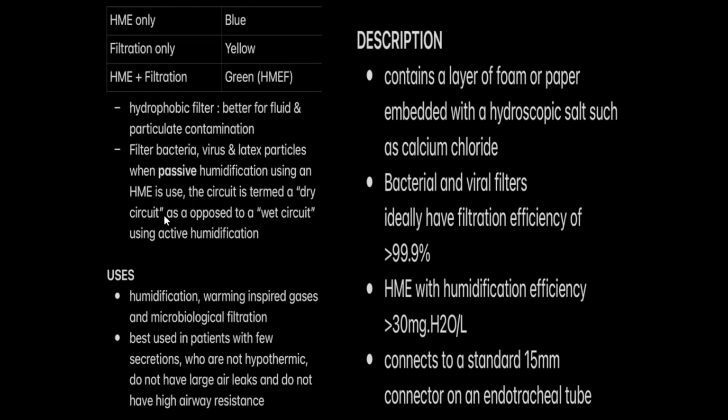The circuit is termed a dry circuit, as opposed to a wet circuit using active humidification. Active humidification is your ventilator machine, or you use a high flow nasal cannula. We have a humidified water bath, which is not good. That's why the patient will always complain the water is going. It's active humidification that gives patient discomfort. Okay, that is a wet circuit. If you use a high flow nasal cannula, you want to fix the water bath. When you use HME alone, it's a dry circuit.